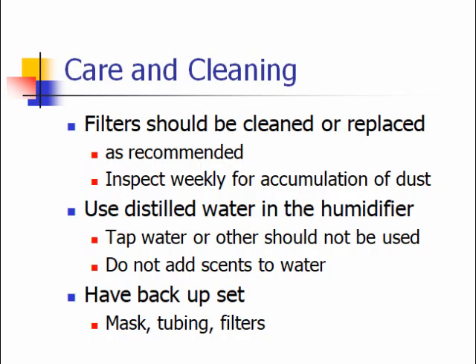Use distilled water in the humidifier. Don't use tap water or other types of water. Don't add scent to the water. Also, have a backup set of mask, tubing, filters. You never know when something can be accidentally damaged or broken.